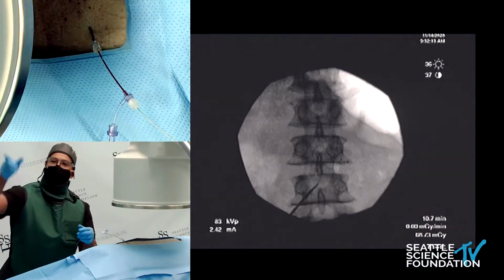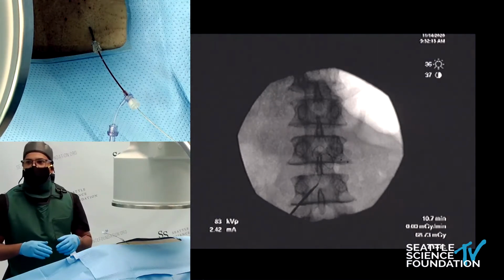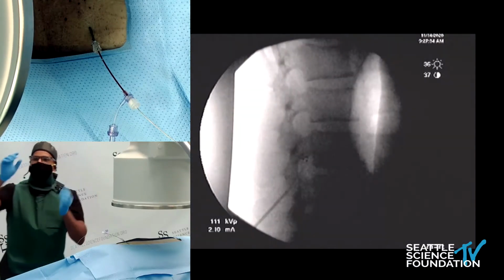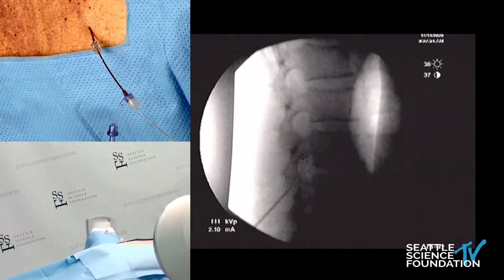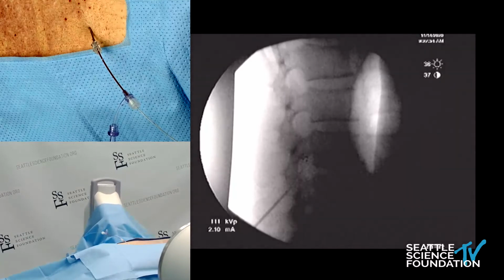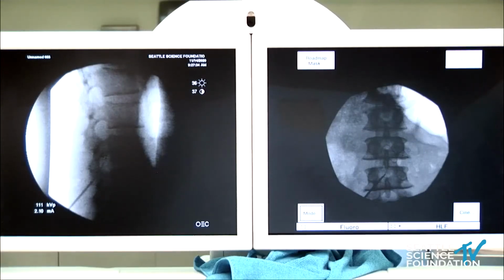So what we've done here is we've created an S, and if we took a lateral, which Justin can do if you don't mind, we'll take a look, because even though it looked like there was a little bit of overlap or crossover, when you look at lateral, there's actually usually a little bit of distance between that contact point. So remember, everything is three-dimensional. Even though under 2D it looks like they're overlying each other or crisscrossing, under lateral you may see that they certainly are not.